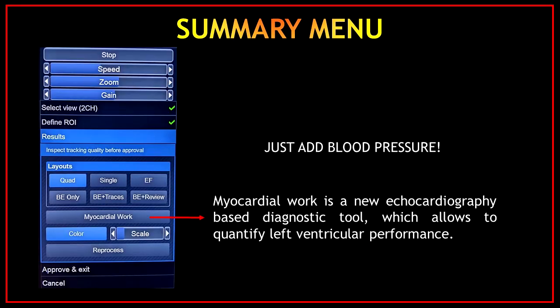Once you have your global longitudinal strain, on the summary menu you will see a button called myocardial work. Myocardial work is a new echocardiography-based diagnostic tool which allows quantification of left ventricular performance. If you are intrigued by this new measurement, all you need to do is click myocardial work and add the blood pressure.